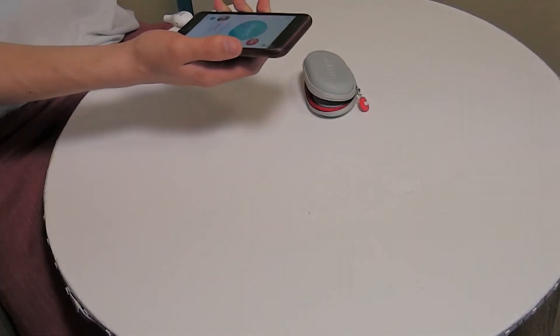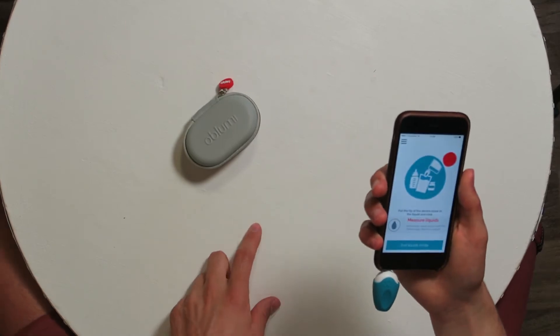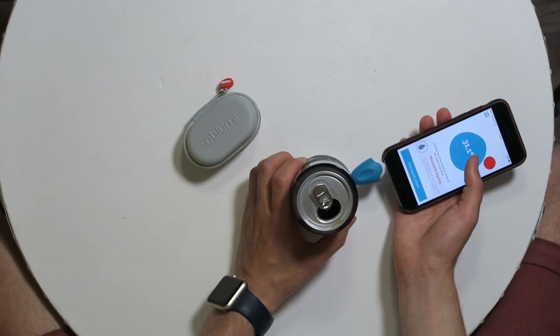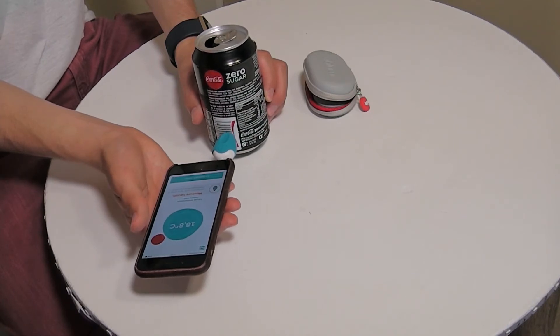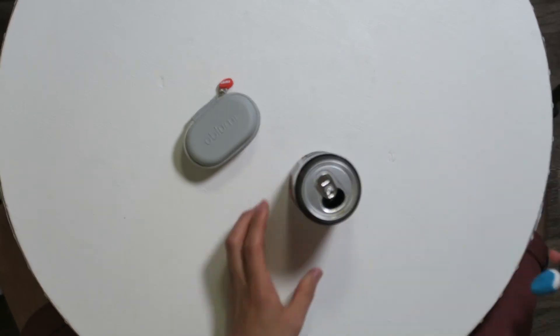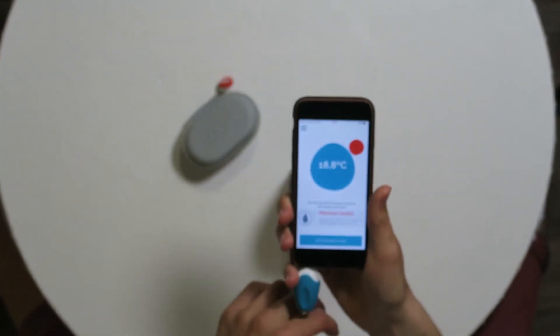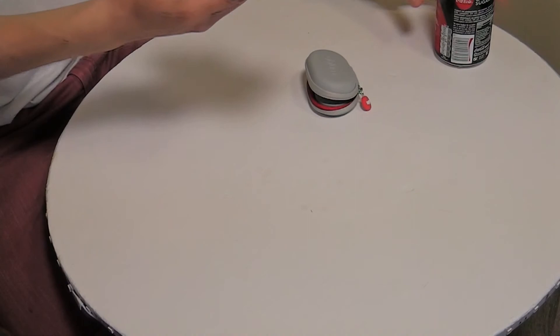You can see a timeline showing how your temperature varies over time, so if you're sick you can track what your temperature is doing — that's really nice. You can also measure liquids. The Coke here is measuring 18 degrees, which seems about right.